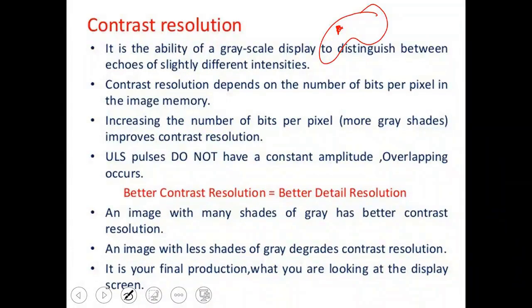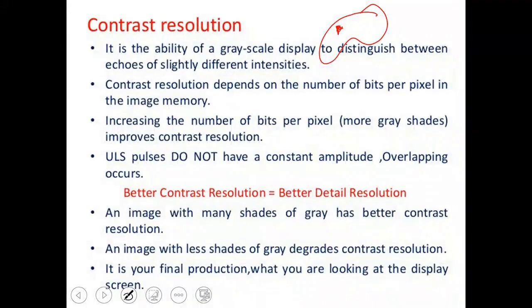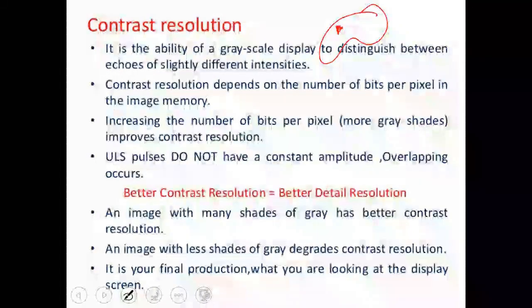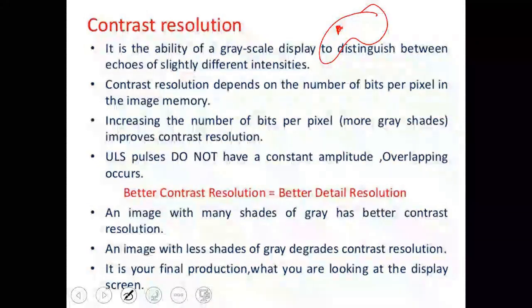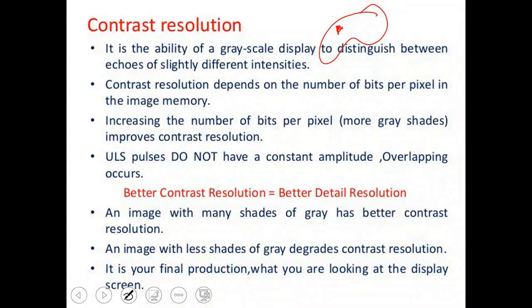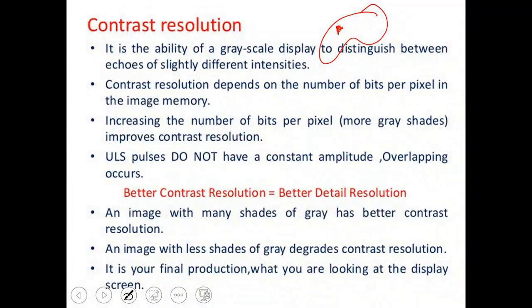If I have focal lesions in the liver, for example a lipoma case, where there is no significant density difference between it and the background, the resolution between it and the background is not very strong, or you need to slightly adjust the window. I call this contrast resolution, which is the machine's ability to enhance the contrast between the lesion and the background. Is that clear? Okay. Is this understood as a concept?